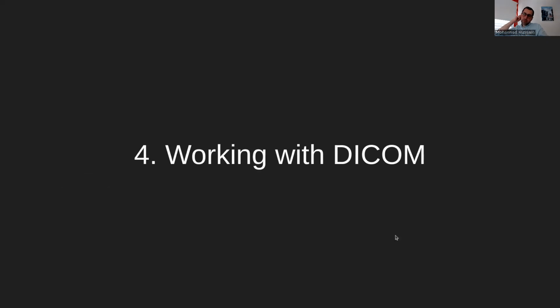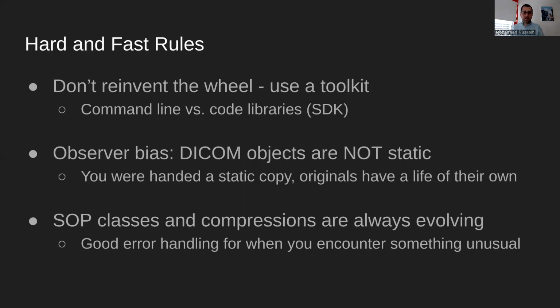So now if you want to pick up your toolbox and development chops and start working with DICOM, how do you actually go about doing that? Well, I'm not going to show you a code example today, but I'll give you some tips that I myself have learned, some of them the hard way. Number one, do not reinvent the wheel. You might be tempted to do it all yourself in DICOM. I highly do not recommend that.